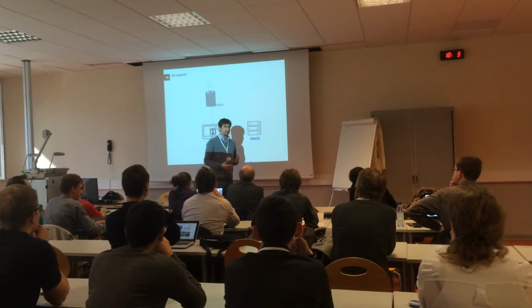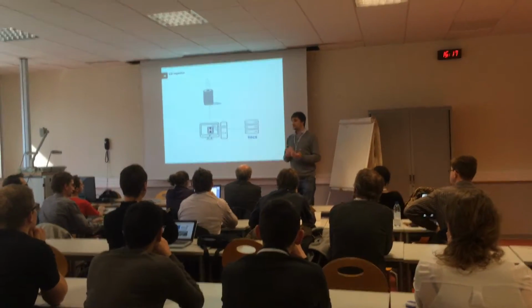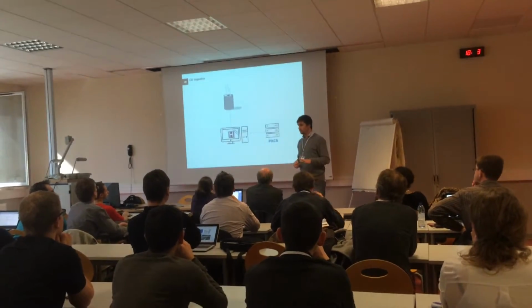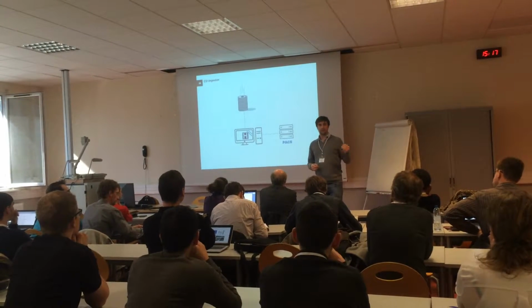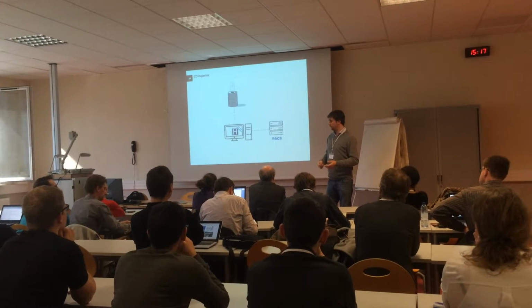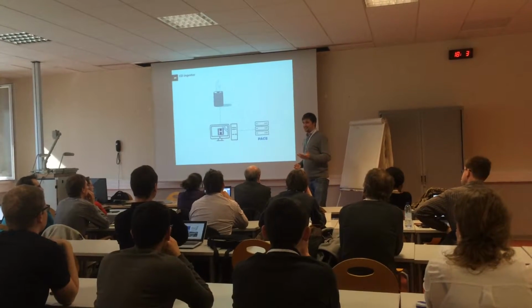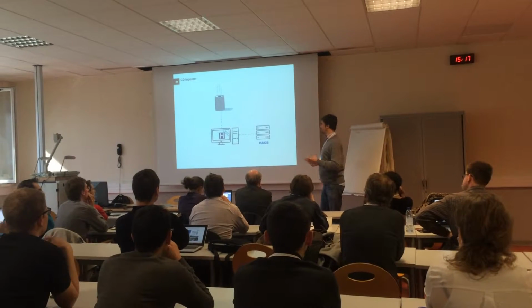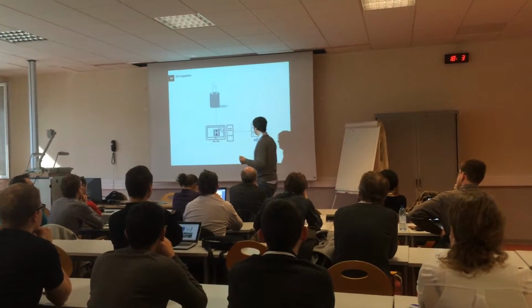A very basic implementation of Orthanc is basically ingesting CDs. You can use Orthanc by having it installed on your computer, and as soon as you enter a CD in your computer, well, very few computers still have CDs, but as we still use CDs, it's used for that. So it ingests the CD and sends it to the PACS.